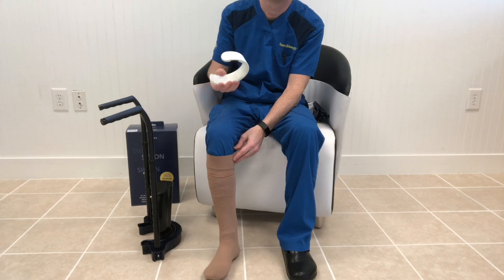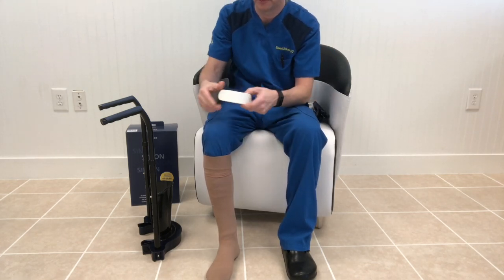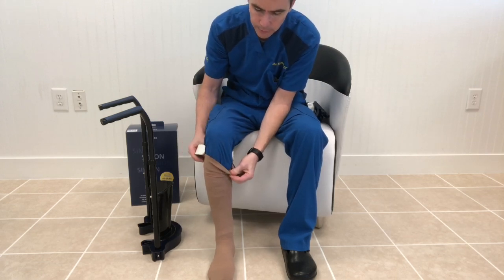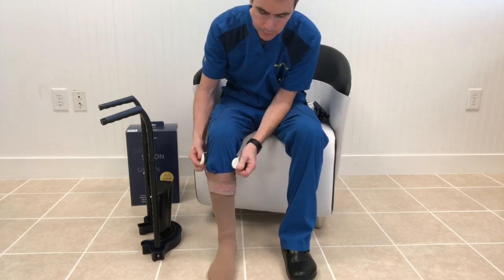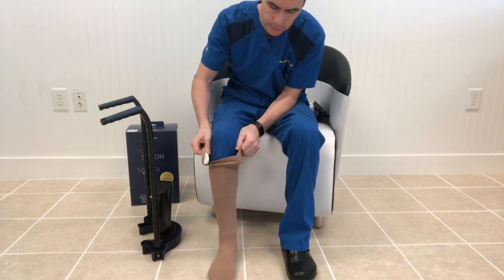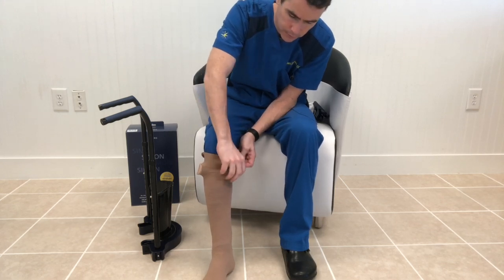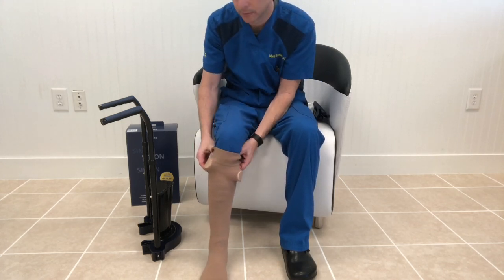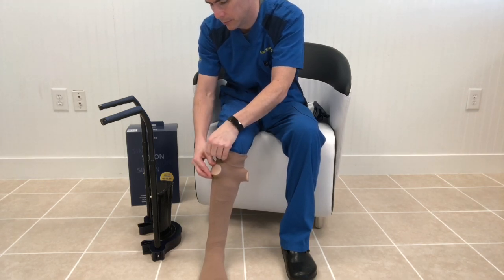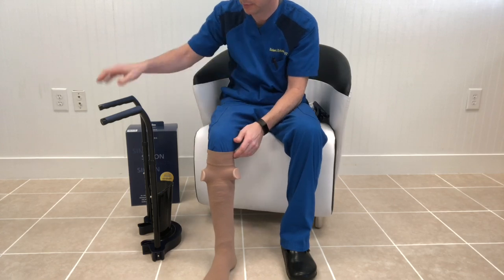So we're going to show how to take compression stockings off using the Simon. Make sure you have the letters up like that to where you can read them, so that you're not putting the ring in upside down. It will not work upside down because it's narrower at the top and wider at the bottom so that it can wedge into place. So in this example, I'm putting the ring inside of the compression sock. Of course here I'm wearing pants, which you wouldn't be doing, so the ring would be up against the skin.